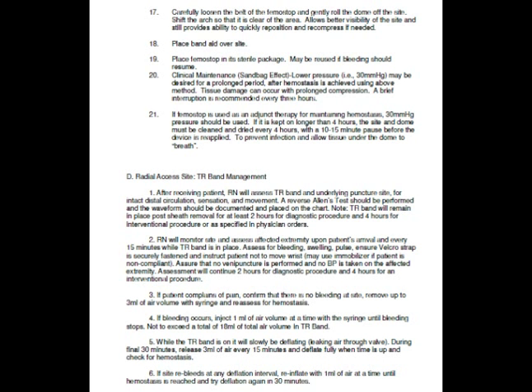If the patient complains of pain, I didn't mention this before, but you can remove up to 3 milliliters of air. I'd just do 1 cc, see if that improves the pain, then do 2. If that doesn't improve it, then do 3. If bleeding reoccurs, you can inject 1 milliliter of air at a time with a syringe until the bleeding stops. And the total volume that is allowed of air in your TR band is 18 milliliters.